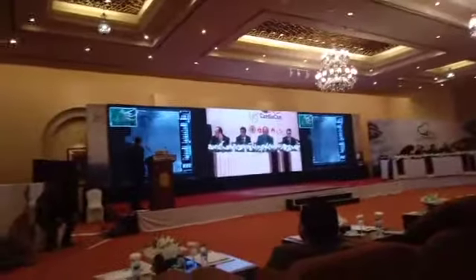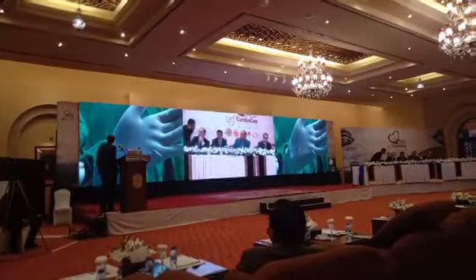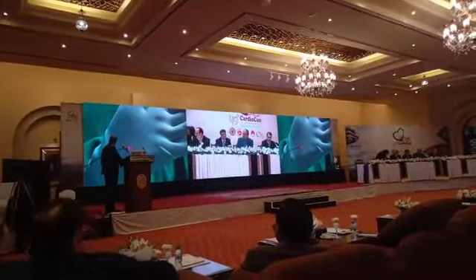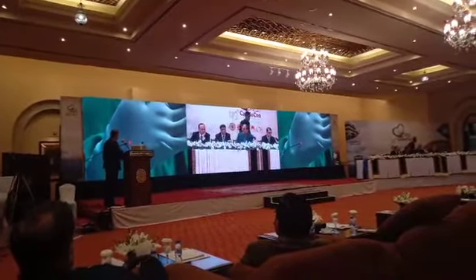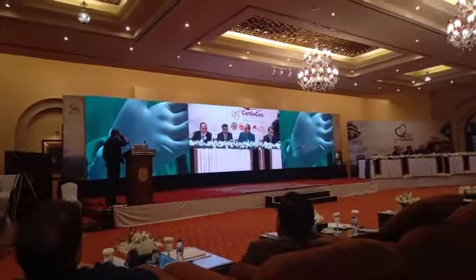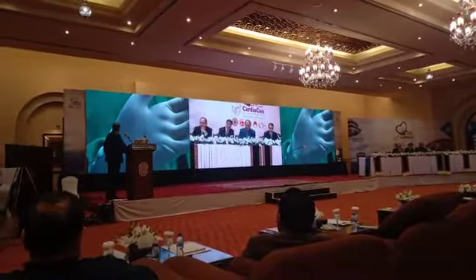I don't know if you can see my hand. There's a red light at the tip of it, which is basically the eccentric laser electrodes which are placed eccentrically around this catheter tip. So we've already calibrated this device, and we're going to start advancing this up into the patient.